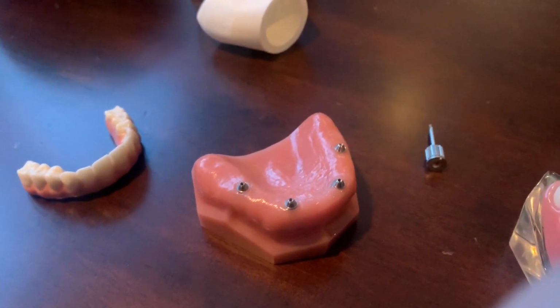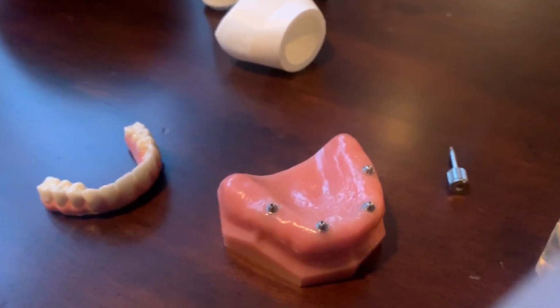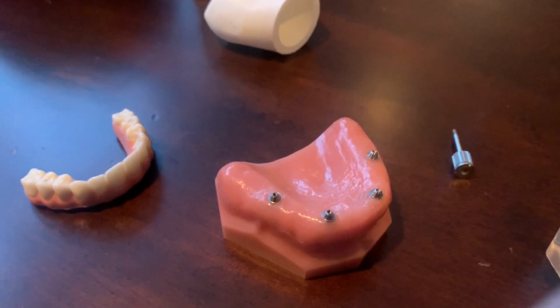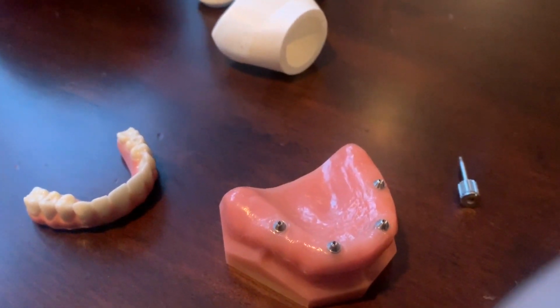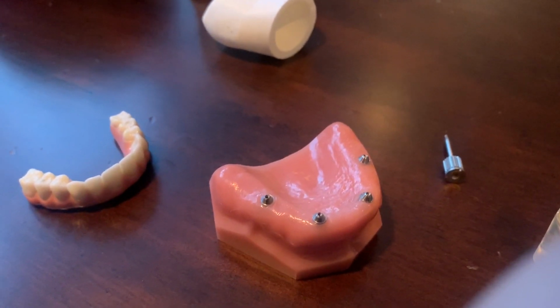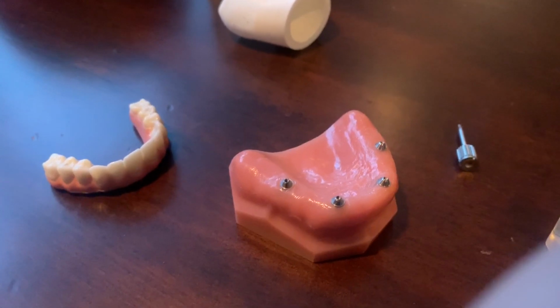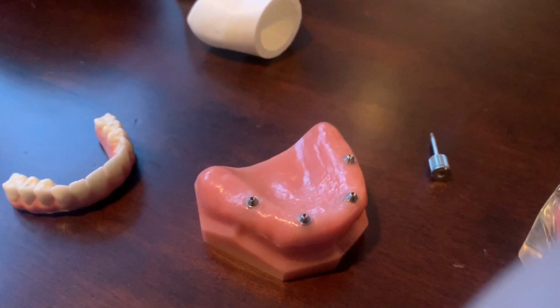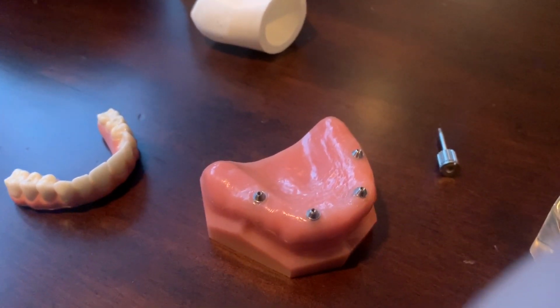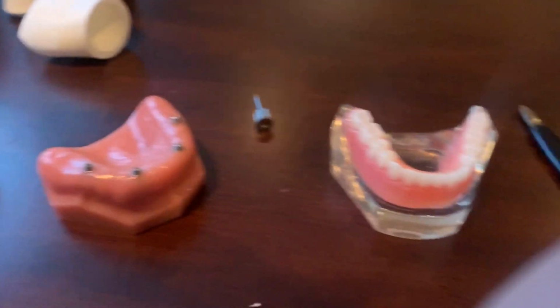I always do these cases with 5 or 6, just depending on how big the person's jaw is. And if nothing else, if you put in 5 or 6 implants and you're waiting for everything to heal, and then you get to the point where you're going to finish the case and make the bridge, there's a healing period, and then you put the bridge on there. Let's say one of the implants doesn't work. If you have 5 implants that actually heal and you lose one of them, you can still move forward and finish the case up.